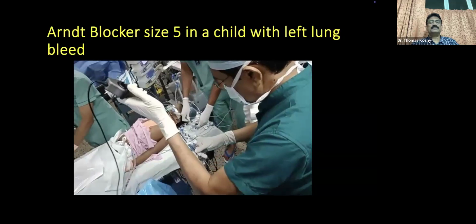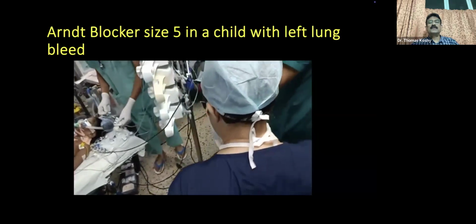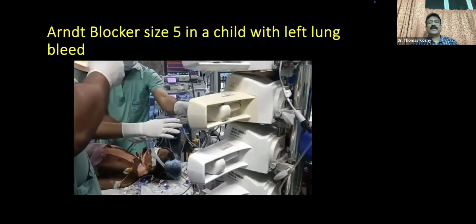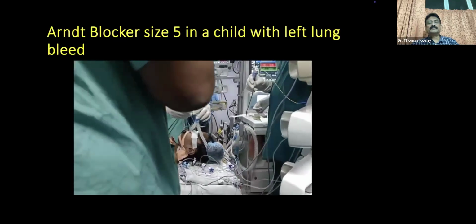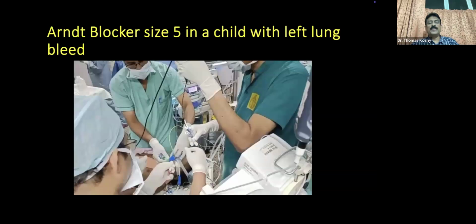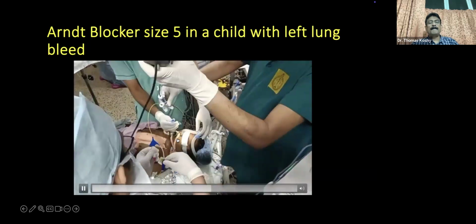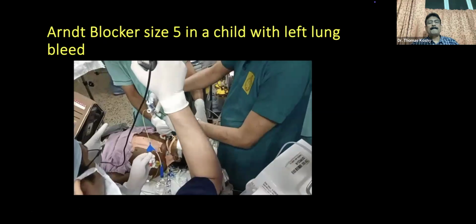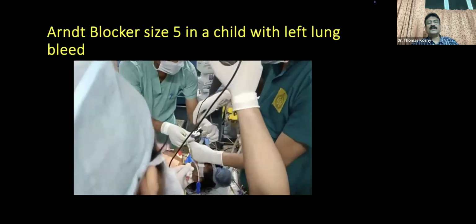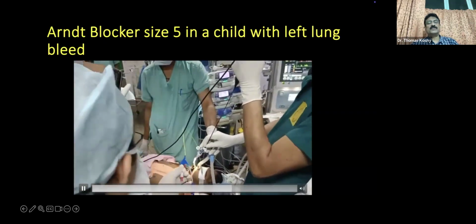So here you can see the patient intubated and kept on the ventilator. The FOB cable is connected to the monitor. The whole unit with the FOB and the blocker is connected to the endotracheal tube. Since our technician is connecting the circuit here, we can continue to ventilate the patient while we are positioning.